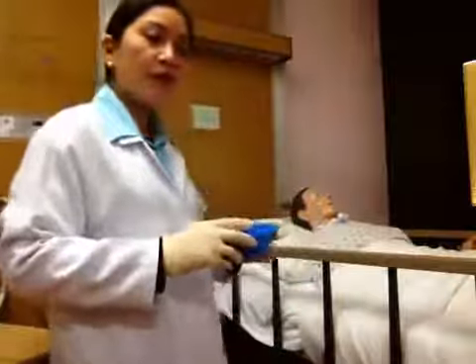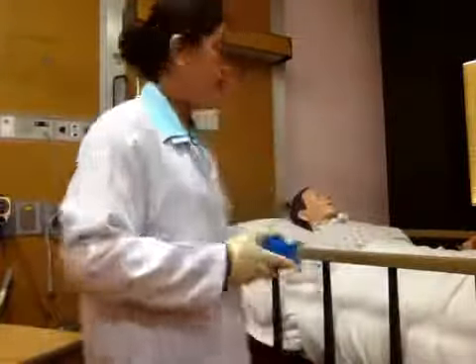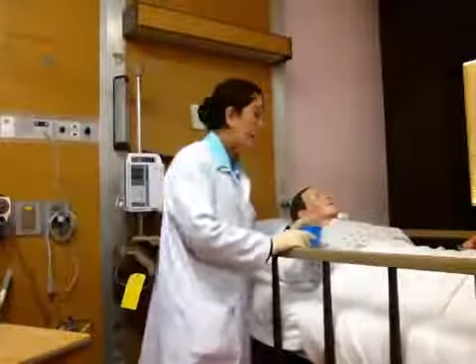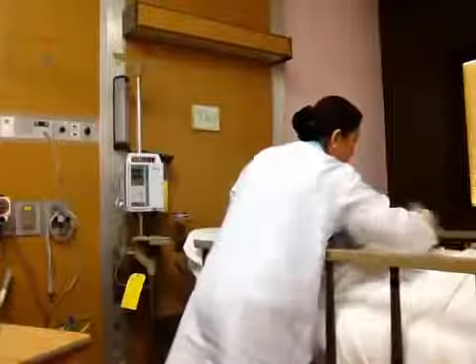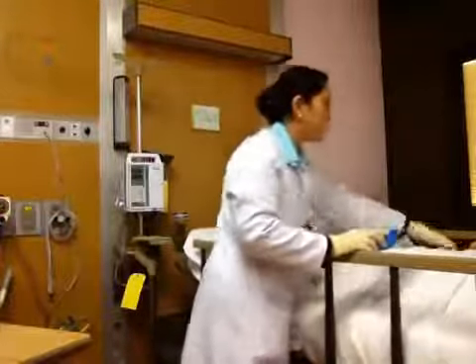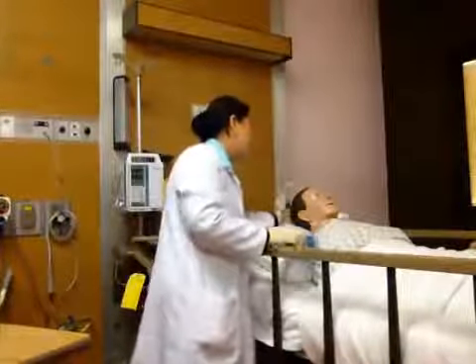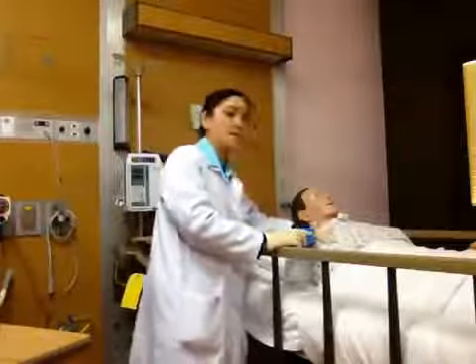Okay, now I'm going to give subcutaneous injection to our patient. Of course, we have to wear disposable gloves or clean gloves as our protection. We have to identify our patient correctly, explain the procedure, and provide privacy. Sister, what is your name? She said, I'm Aisha. Okay, Aisha, can I check your identity band? Okay, this is Aisha Marie, so she is the correct patient. Aisha, I'm going to give your medication through subcutaneous injection. And then she said, okay, thank you, sister.